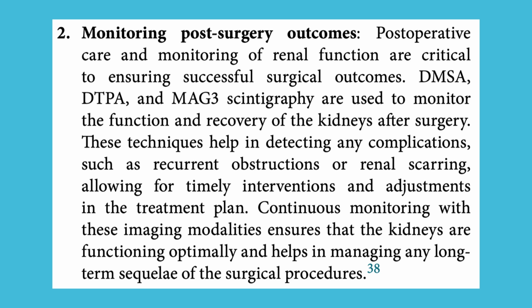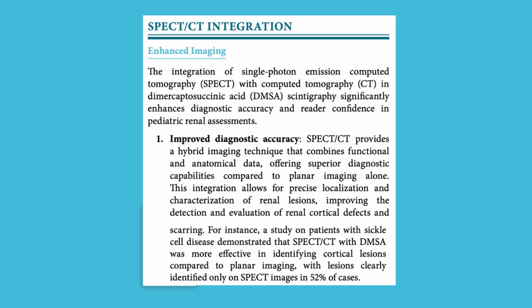DMSA, DTPA, and MAG3 scintigraphy are used to monitor the function and recovery of the kidneys after surgery. These techniques help in detecting any complications, such as recurrent obstructions or renal scarring, allowing for timely interventions and adjustments in the treatment plan. Continuous monitoring with these imaging modalities ensures that the kidneys are functioning optimally and helps in managing any long-term sequelae of the surgical procedures.